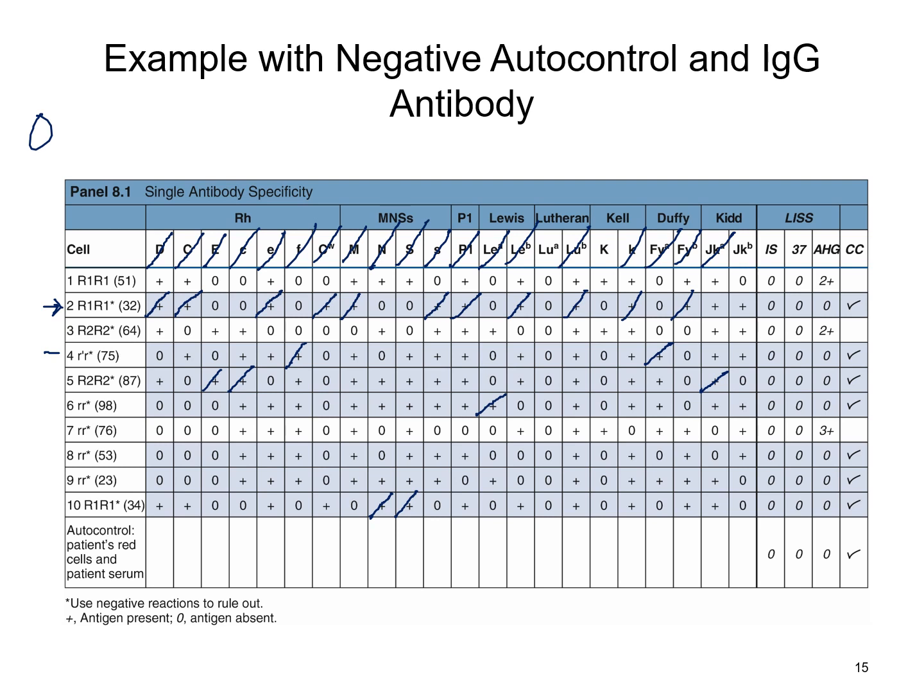Lutheran A, there are no antigens present on any of these donors for Lutheran A. It's highly unlikely that it is a Lutheran A. Kell, nothing there. And then JKB, I can actually rule out on number 8.